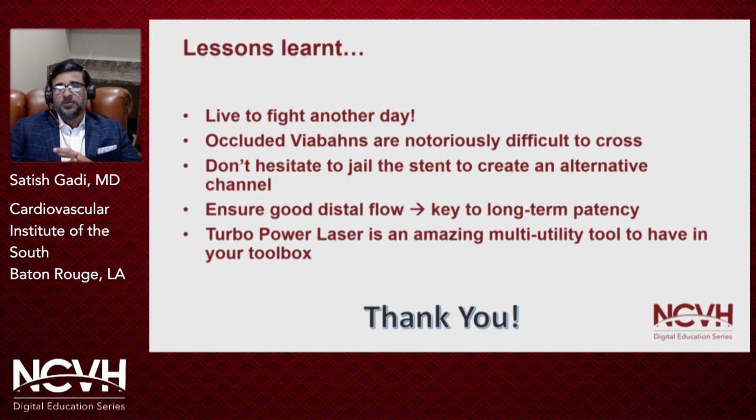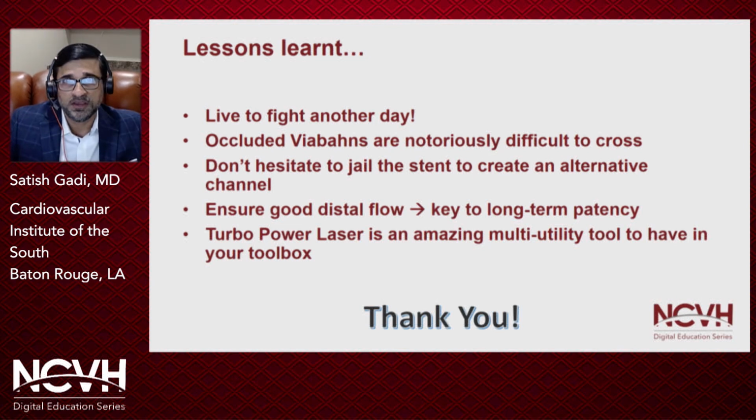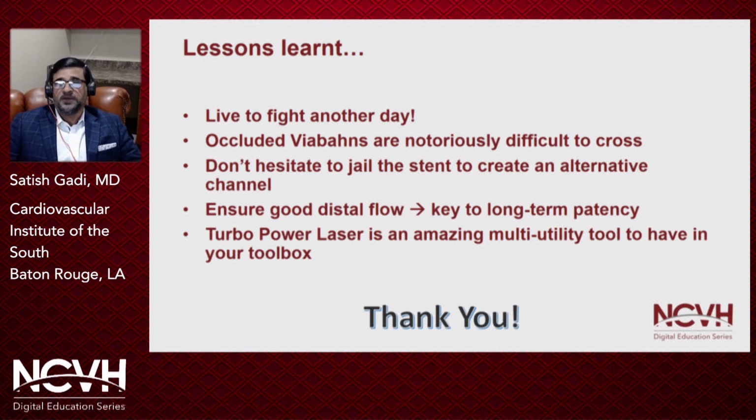Third and extremely important point, ensure a good brisk distal runoff. If that is not there, then whatever you did may go to waste. The key to long-term patency is ensuring good distal flow. And the fourth point that I learned is the Turbo Power laser catheter is an amazing tool to have in your toolbox. Not only can you do really good, effective atherectomy, but laser atherectomy is pretty much the only choice if you want to do an atherectomy in an occluded stent. And also, the laser catheter is a great crossing tool. So for all those reasons, this is an amazing tool to have.